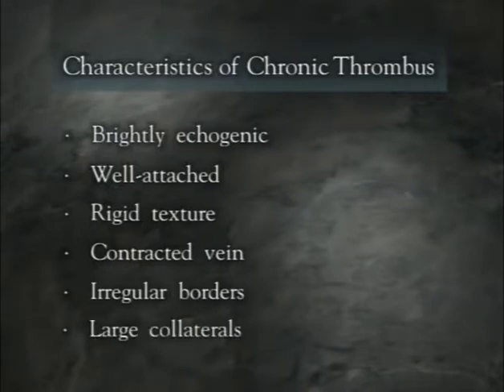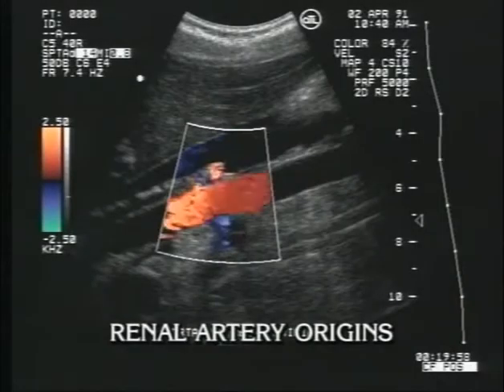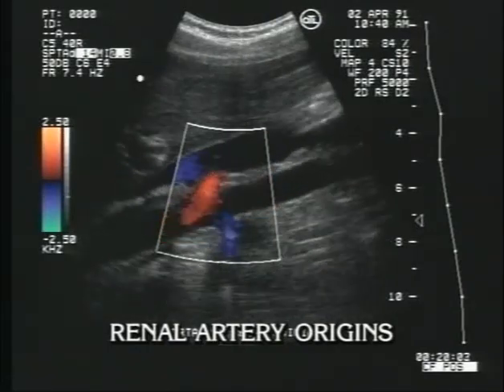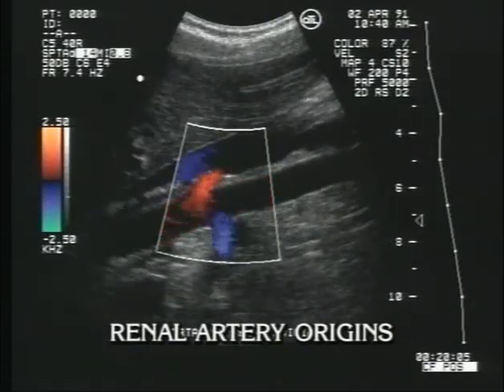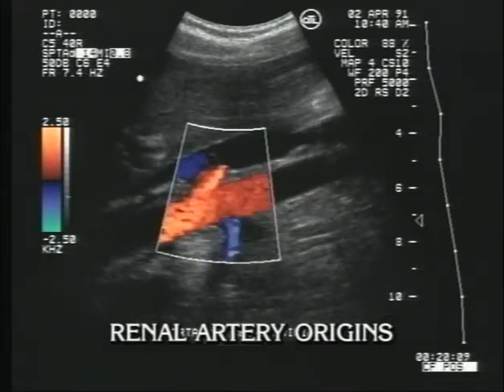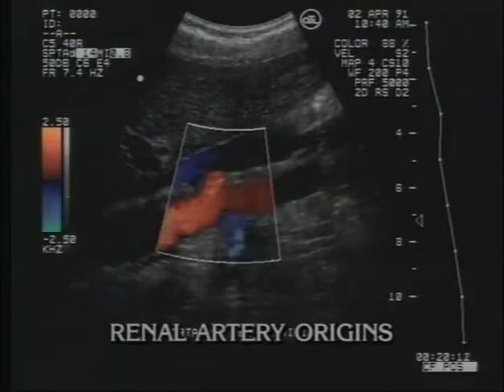The normal visceral artery is echo-free and noticeably pulsatile. The abdominal arteries vary in size from the large freeway, the aorta, to the smaller intersections, such as the renal arteries, and the small side branches, the vessels within the organs.